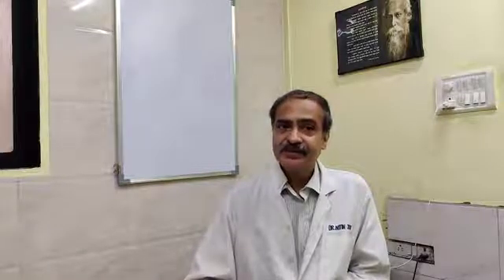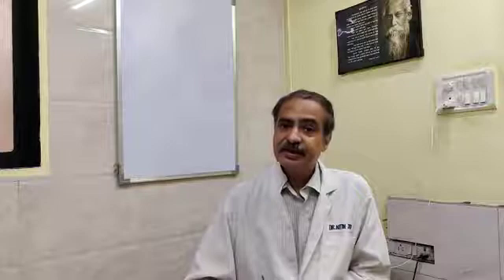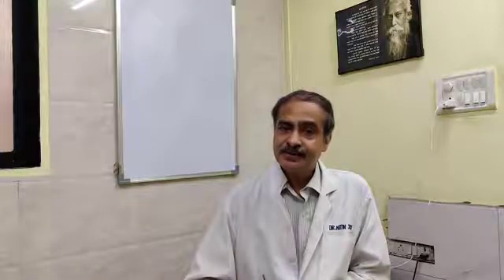Answer: sir, as soon as I diagnose that there is a threatened perforation or covered perforation, I will try to terminate the procedure as early as possible. I will try to achieve the best possible hemostasis in the shortest possible time. Third, in order to reduce the amount of extravasation, I will do certain things. One, I will frequently empty the bladder so as to reduce over-distension of the bladder, which causes raised intravesical pressure and more extravasation of fluid. Second, I will reduce the hydrostatic pressure in the irrigation tubing by decreasing the rate and height of irrigation.